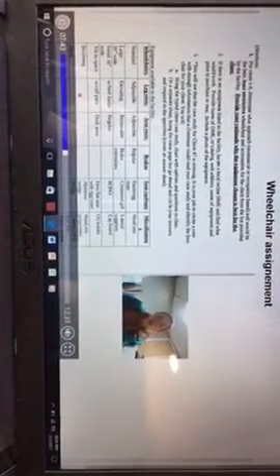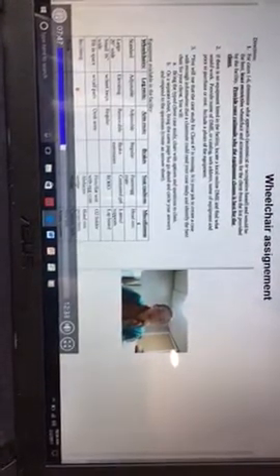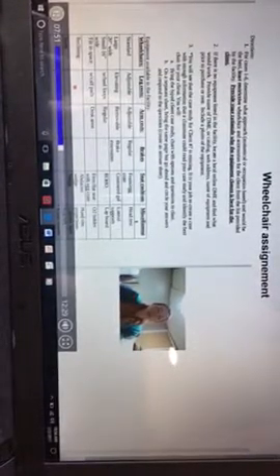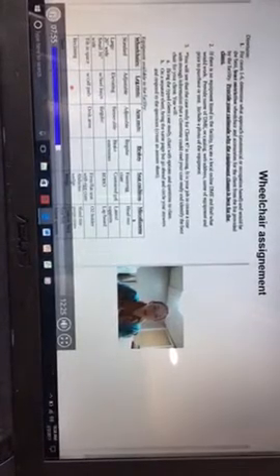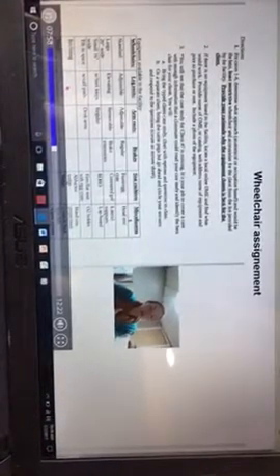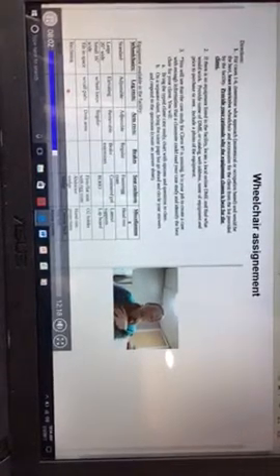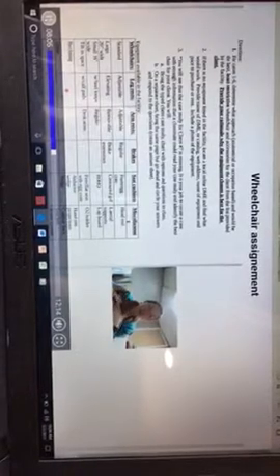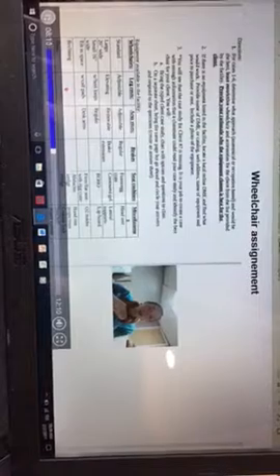The Rojo is an air cushion. It's the most popular type of air cushion out there. So air is probably the most optimal if you have bed sores and different kinds of ulcers on your sitting surface. The downside is they're very high maintenance. So for somebody who, again, isn't cognitively intact and able to be regularly tuned into monitoring the air, that could be an issue.